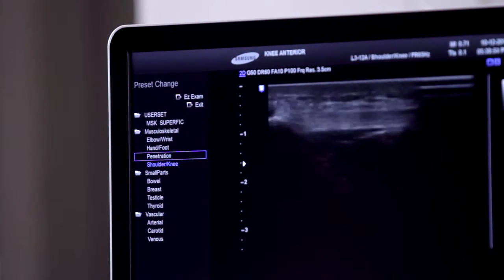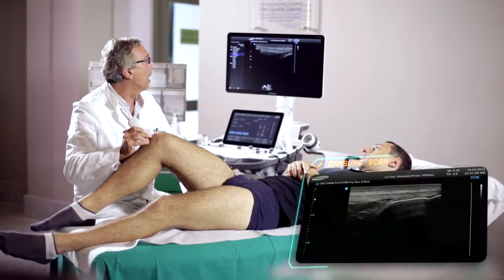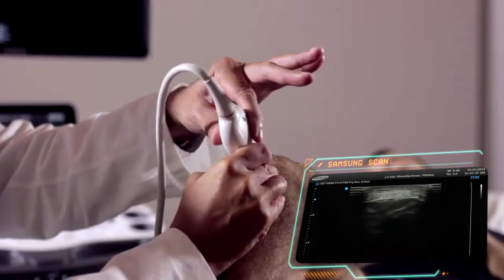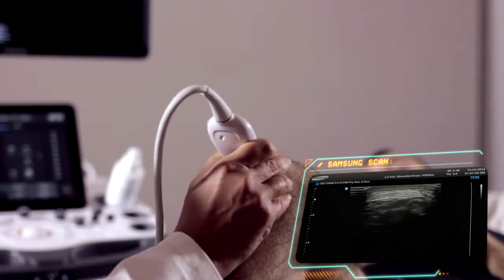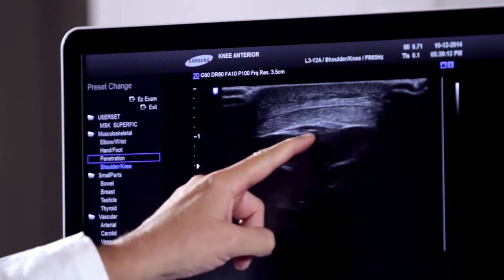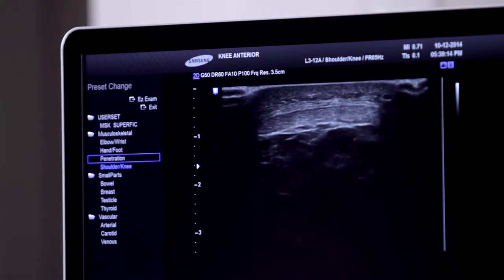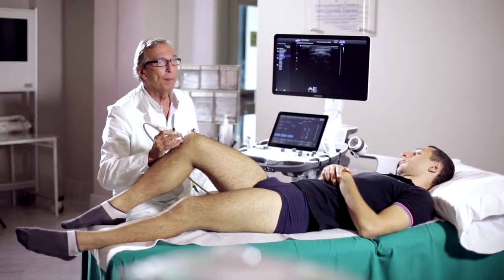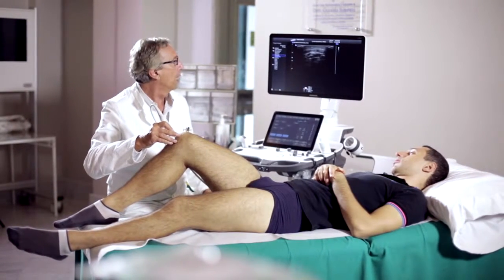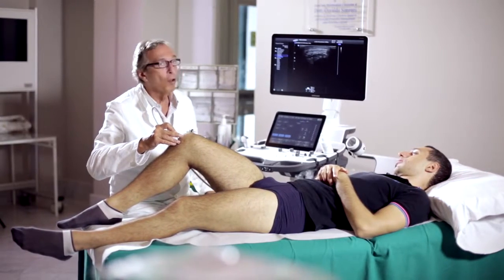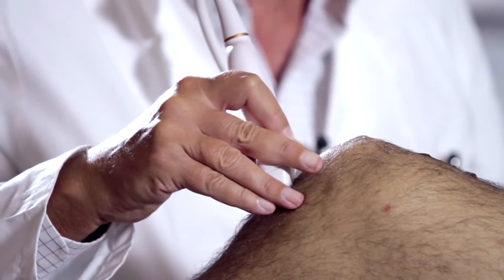This tendon may be studied very well using ultrasound scans. It is a tendon that has a thin morphology, so thin that when we do the scans internally, rotating the transducer clockwise by 90 degrees, we can see its classic thin morphology with a concave ventral profile, which is a feature of this tendon. We have to be very careful to scan it properly, because if the transducer is not perfectly perpendicular, the scan will be incorrect due to the anisotropy phenomenon and the tendon will not be measurable as it looks hypoechoic.